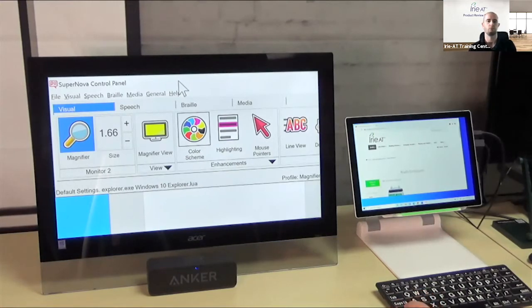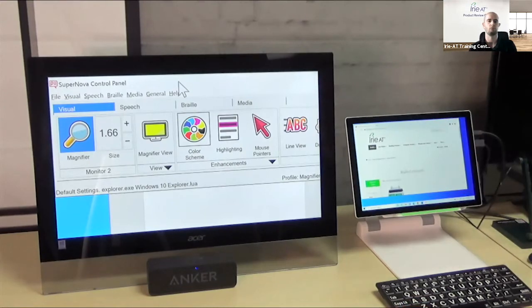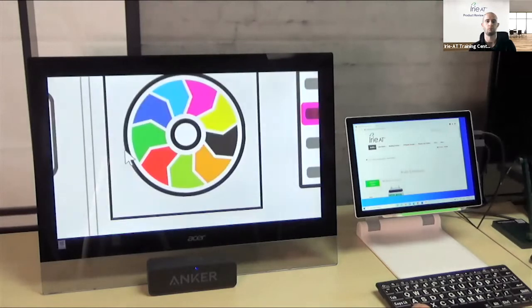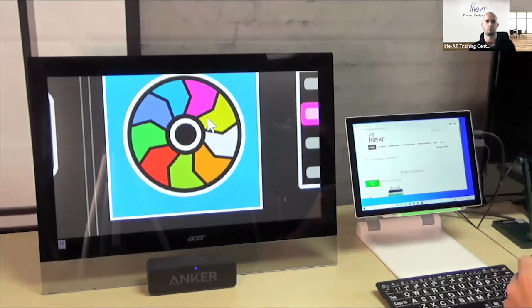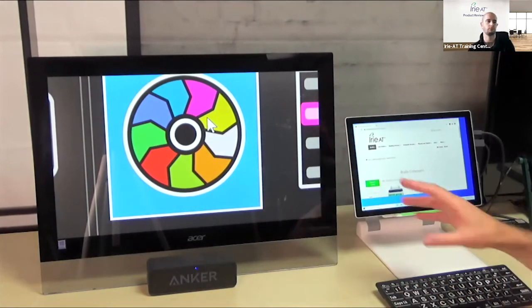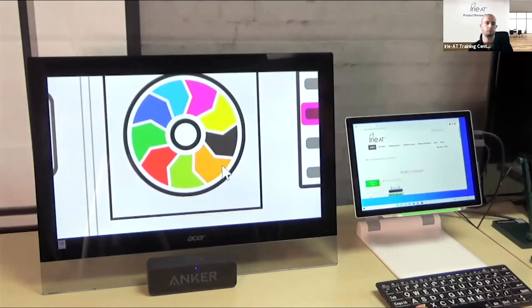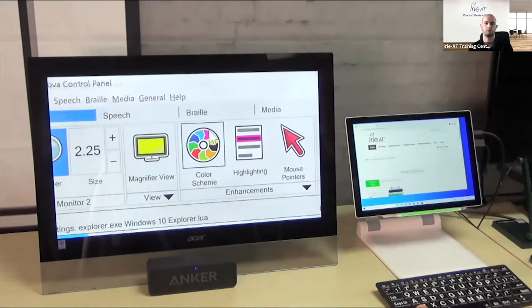If you can see these screens, you'll see that as I change the magnification on the large screen here, it doesn't change anything on the other screen. This is completely independent. Same thing with the contrast. Everything's going to be related to this monitor. So I can show sighted people who don't need magnification, and have different magnification for notes I'm looking at live, or any number of reasons. You want to be able to have this be an independent function, so you can definitely do that on either one.